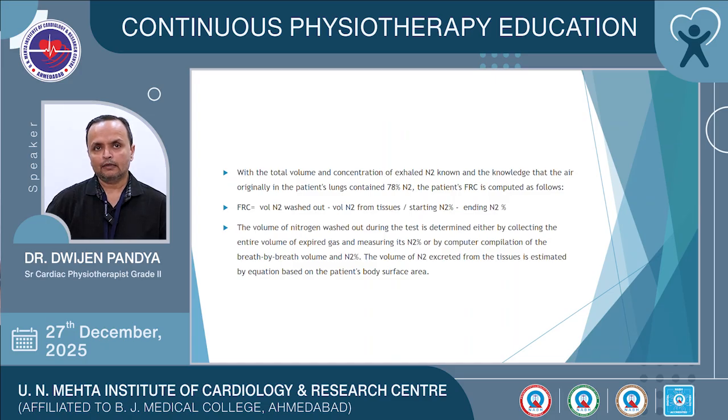With the total volume and concentration of exhaled nitrogen known and the knowledge that the air originally in the patient's lungs contains 78% nitrogen, the patient's FRC is computed as follows. FRC is equal to the volume of nitrogen washed out minus the volume of nitrogen from the tissues, divided by starting nitrogen concentration minus the ending nitrogen concentration.